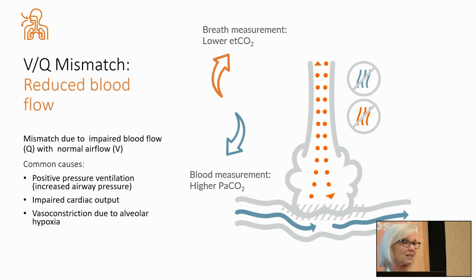But before she did it, they said, we want to see what his transcutaneous CO2 is. So we go in there. They happen to actually have a monitor at another part of the facility, so we got their monitor and put it on the patient. His end-tidal was reading 50. And the transcutaneous value is climbing and climbing and climbing, and it finally stabilizes at 80. And we're like, wow, that's a big difference, 30-point difference, right? That's significant. Which one is right?